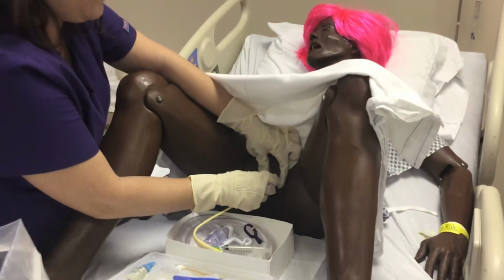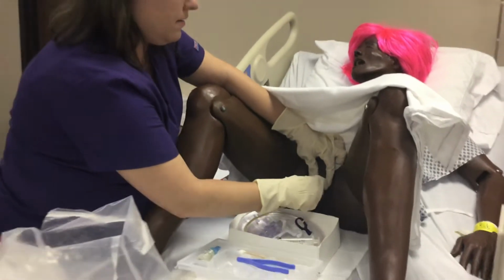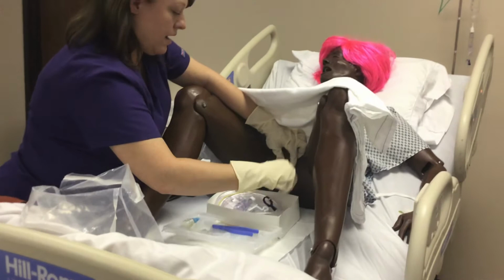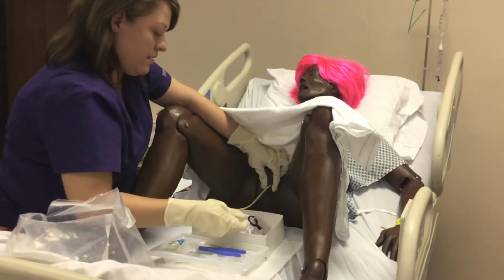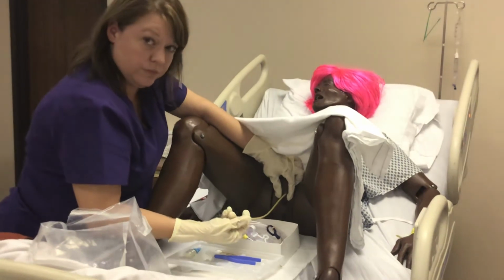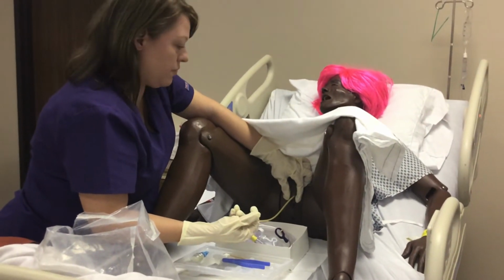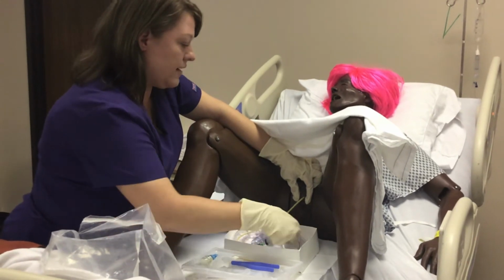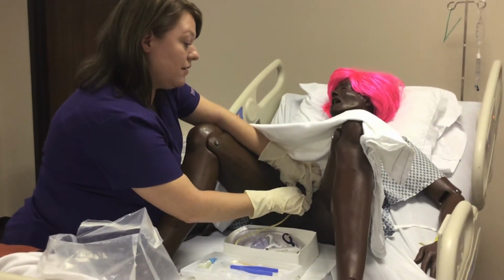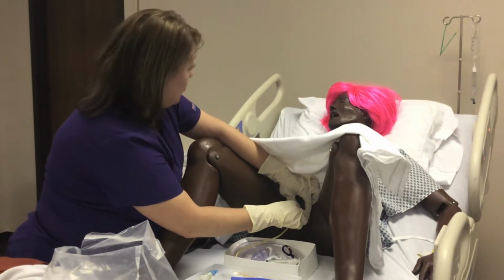And now, without releasing the labia, I'm keeping that out. I'm going to go ahead and inflate the balloon. Okay, you still doing okay, Miss Shelton? All right, perfect. Now I'm just going to give it a light tug. I do feel that resistance, so the balloon is inflated and we're good.